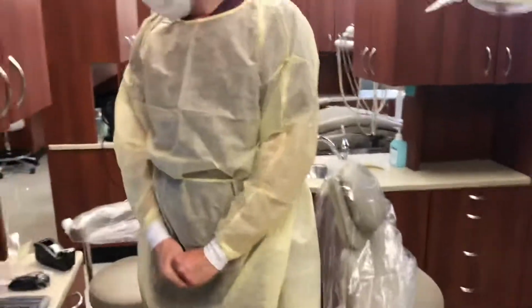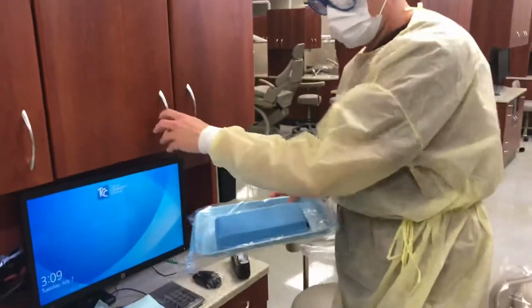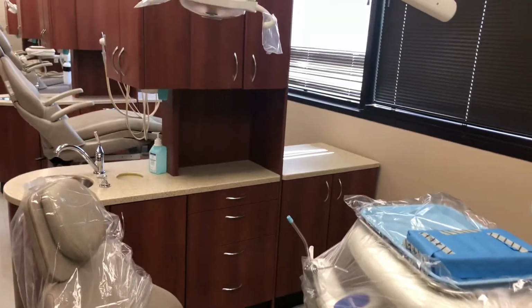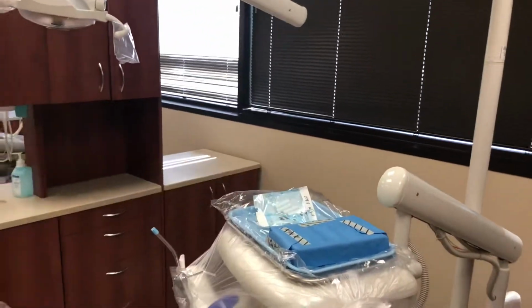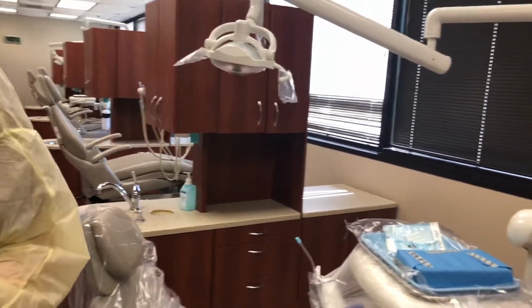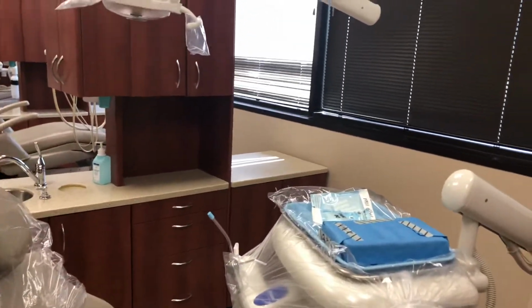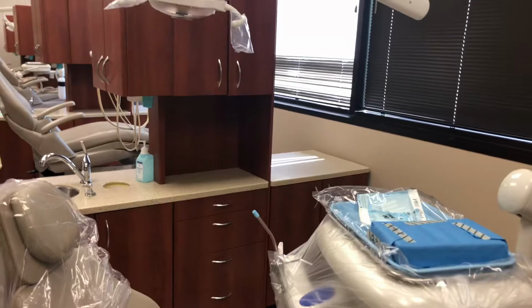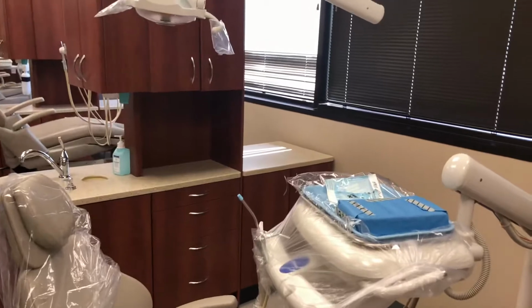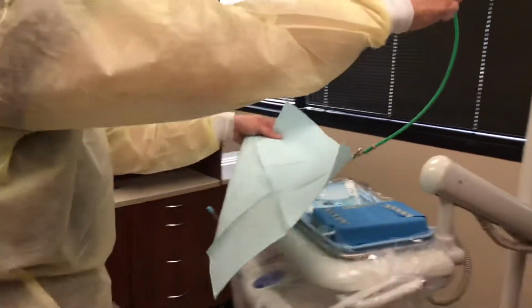Place unopened instrument cassette, cotton roll packet if needed, and 2x2 gauze packet on bracket tray. Secure bib clips to the patient bib and place on bracket tray. But that will be later in the step because we will actually, nope, that is correct. I'm sorry. Place it on the bracket tray.